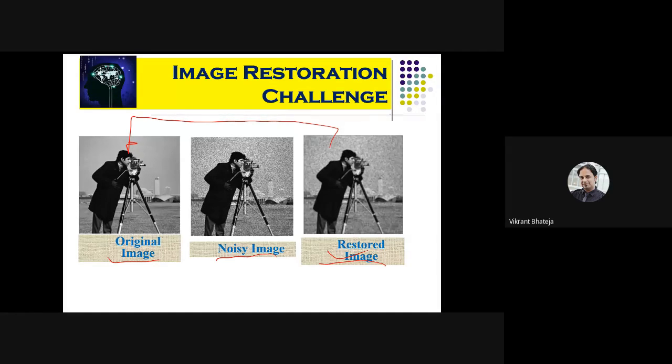But now say if we apply the same concept to medical images, or say mammographic images. Now you have an original image over here, which is a mammogram, and a restored image, which may be the improved version of that image.